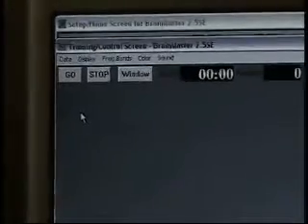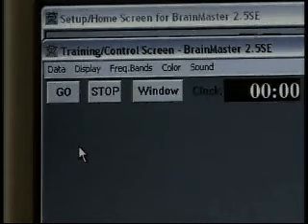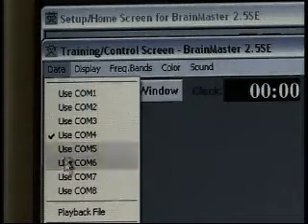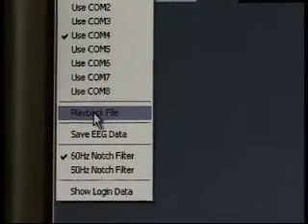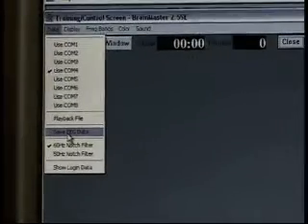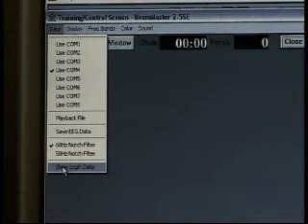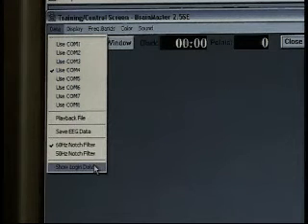Looking up at the top as we zoom in, we have a couple different options. A lot of the windows we've just gone through — we've given you access to some of those settings live from the training screen. For instance, as I click on Data, you notice that I can choose a COM port. I can play back a file if it was saved EEG, save EEG to disk, select notch filters, and even show the login data. So a lot of this is access to information we've already gone through, but you have that live access to it from the training screen.